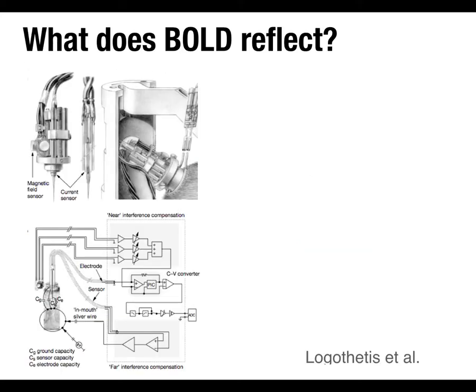All right. Now, that said, it's not voodoo. I've already shown you at a molecular level the relationship that we understand between neural activity and BOLD response. But this group, led by Nikos Logothetis in Germany, showed this in vivo in monkeys. This experiment was published in the early 2000s, I think, and was a huge tour de force in terms of the technical development that was required.